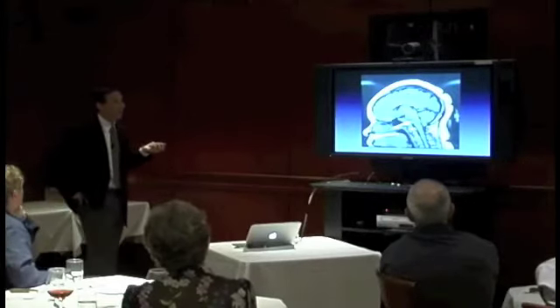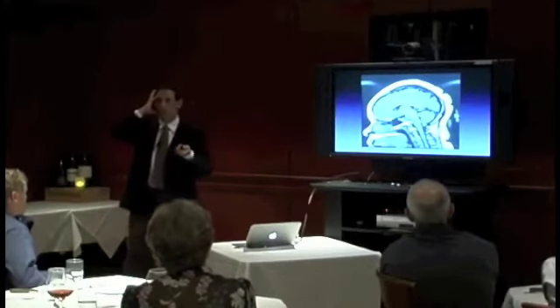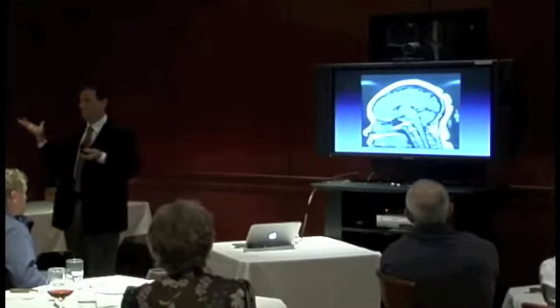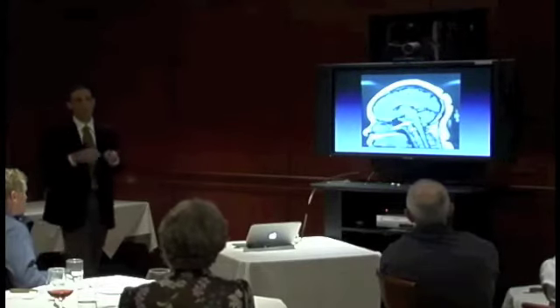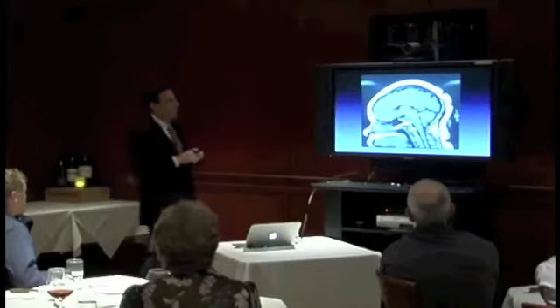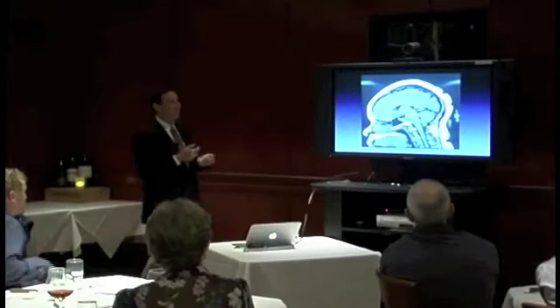this problem. Well, the traditional approach for that is a huge procedure where you literally are opening up half the head. It takes probably about 10 to 12 hours to get to this area. And with that approach, you're still not going to remove all of this tumor. So you say to yourself, why not just come straight back through the nose? And that's what we did.